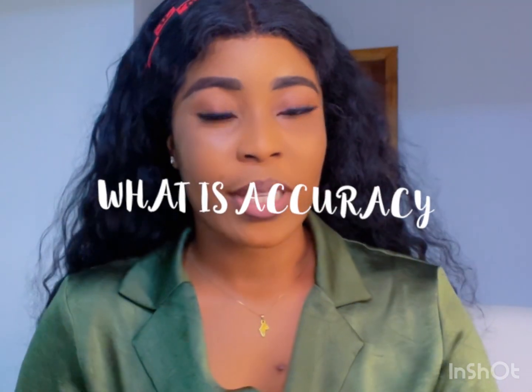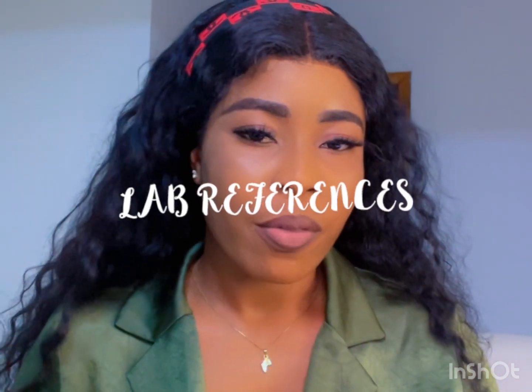Today, I mentioned that we're going to talk about the accuracy of a blood glucose monitoring system. What is accuracy? Let's start with that. Accuracy is the trueness of the results. Again, accuracy is the state of being correct or precise. Technically, accuracy can also be termed as the degree to which the results of a measurement or calculation or specification conforms to a particular value or standards. Accuracy is also determined by how well it corresponds to the lab reference.